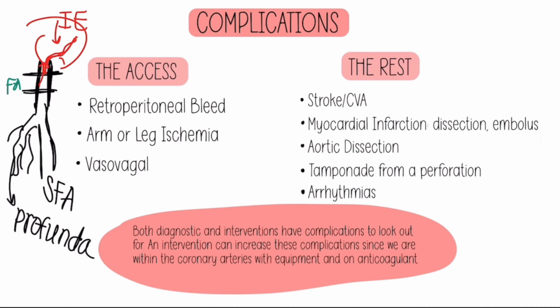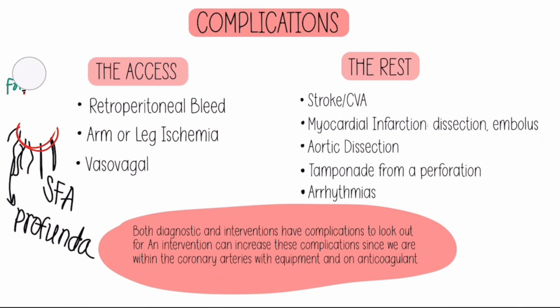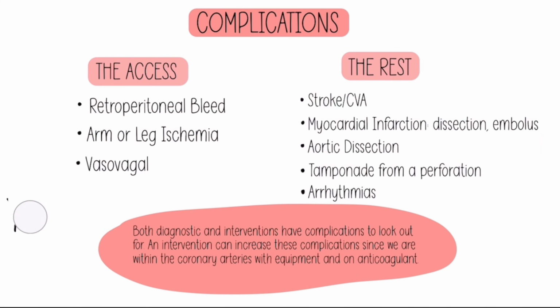But it is something that you can avoid by using ultrasound, taking an angiogram image, seeing where you are in relation to the epigastric, in relation to the bifurcation. And if it is too high, that's why you see people using micropunctures, so that you can pull that needle and that small catheter or small sheath out at that time, hold hemostasis and try an alternative access. So definitely avoidable, just something to pay attention to if your physician does go femoral a lot. Start to learn what ultrasound images look like, really get familiar with peripheral anatomy and what the femoral angiogram looks like, so that you can identify how good or poor that access site is.